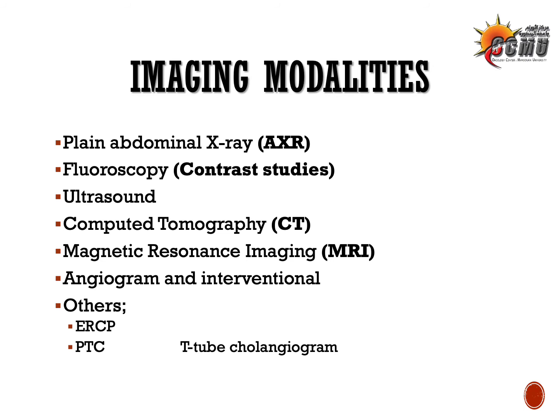So, as we've mentioned, imaging of the GIT might be done without contrast, as we'll be mentioning in more detail in this lecture. Plain abdominal X-ray: it's just like the chest X-ray, but it's an X-ray of the abdomen.